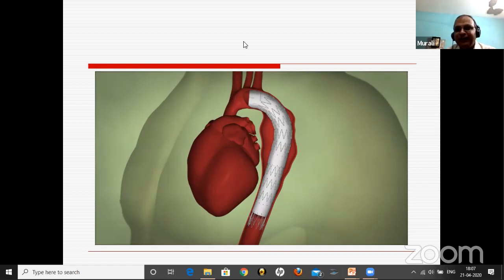Maybe Girish also would have done. These are all patients who have had a coronary done. They have had a pseudoaneurysm, where you put short grafts when they are not fit for open surgery. So right now, don't try all this ascending aortic at this point of time. They are all very tough things. It's called an endo-Bentall. Yeah. That is the new graft coming, but that's all in trial and everything. It will take some time.